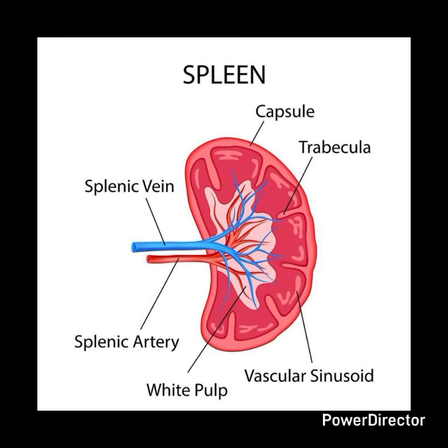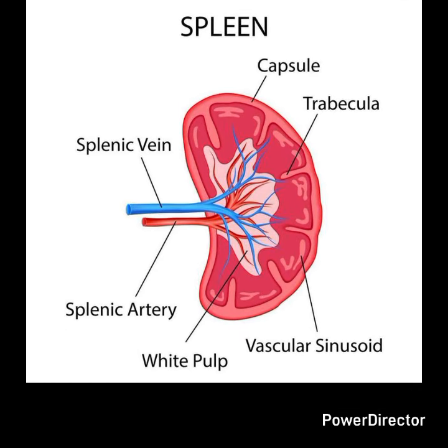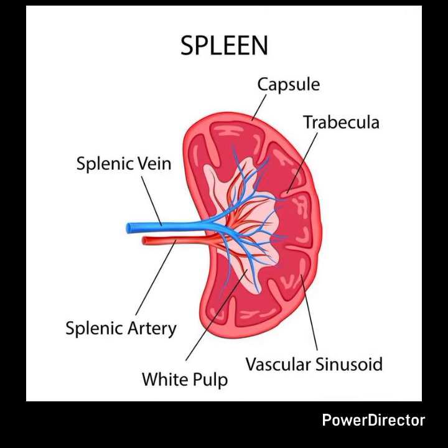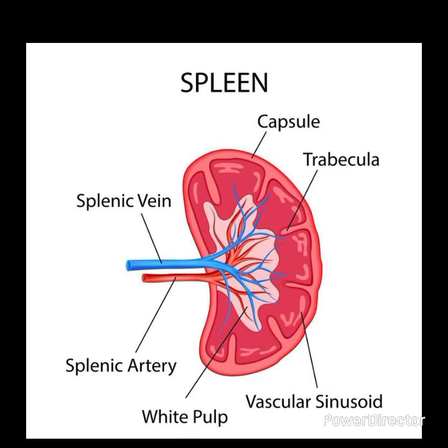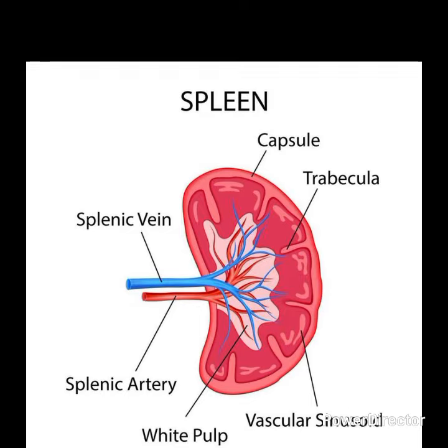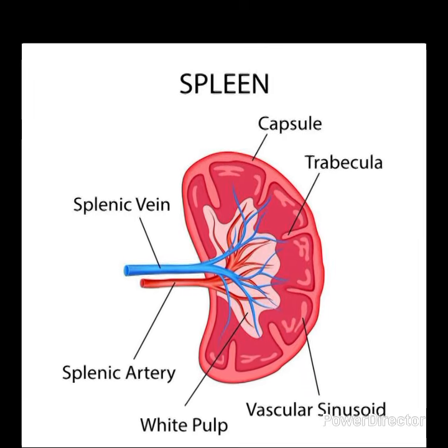Embolic agents: two types of embolic agents are used. One is permanent and one is temporary. Permanent: coils, vascular plugs, particles or glue for durable occlusion. Temporary: gel foam for temporary occlusion, though less effective. So permanent embolic agents are coils, vascular plugs and particles or glue.